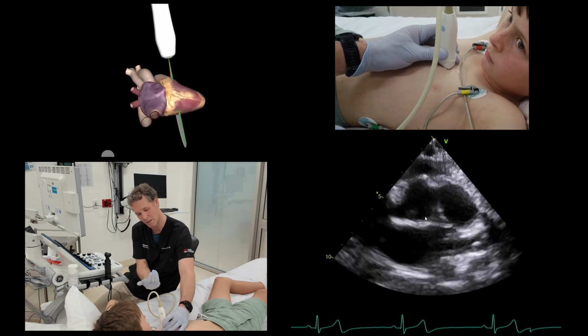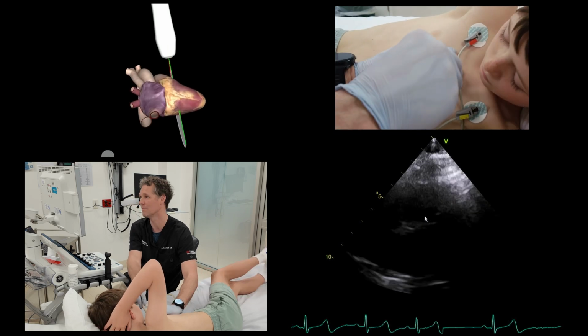Jack, do you mind just rolling over towards me a little bit? That's it. Perfect. Great job, buddy.